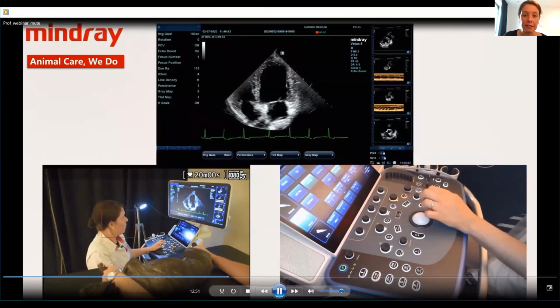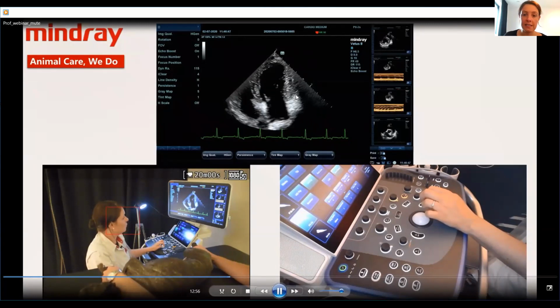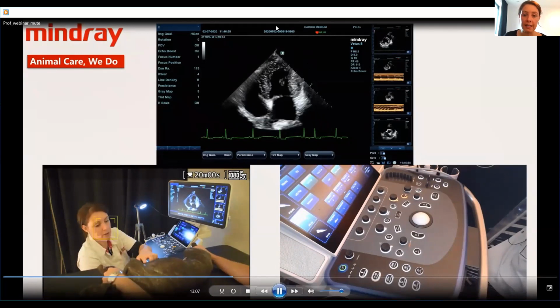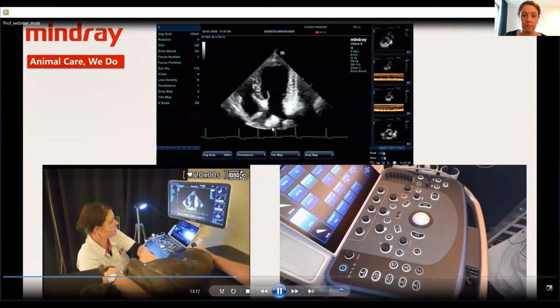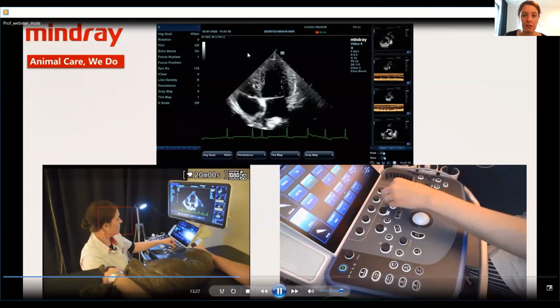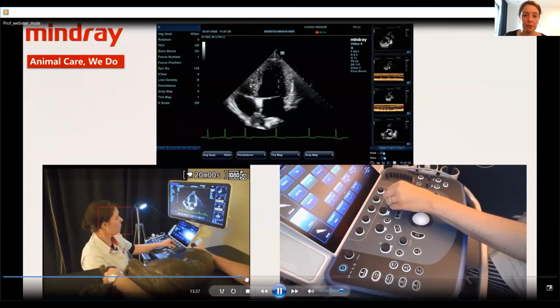So you see here a very nice left apical view, really nice ECG. And this is again an image that allows you to do a very good general assessment of the different cardiac chambers and structures. So we will again record a 2D loop, so actually a video, so that you can do 2D measurements afterwards. Okay, what I'm explaining here is the orientation of the probe. We are scanning actually from here, from the apex. Here is our probe, and we are looking towards the atria, which are here. Okay, so left apical four-chamber view.